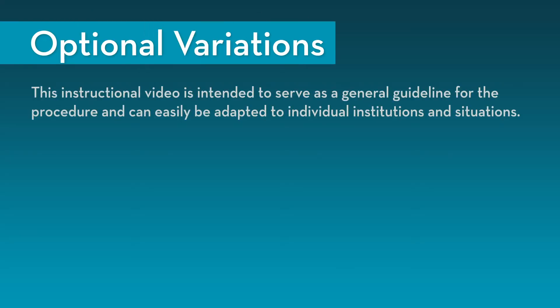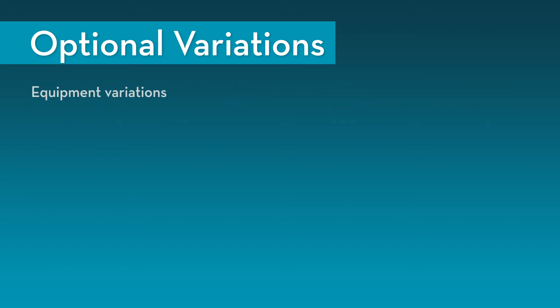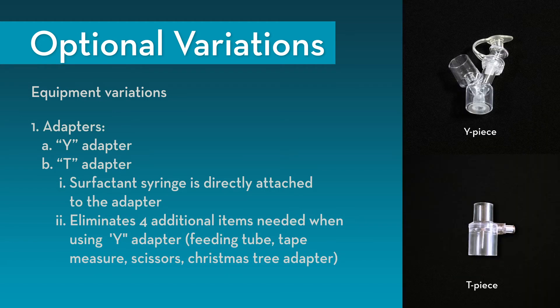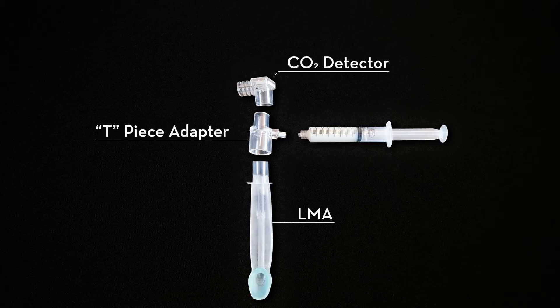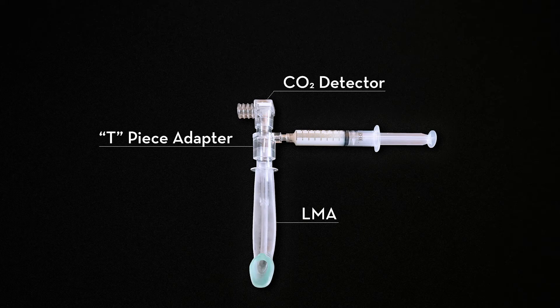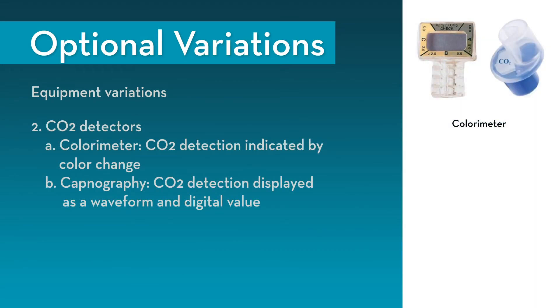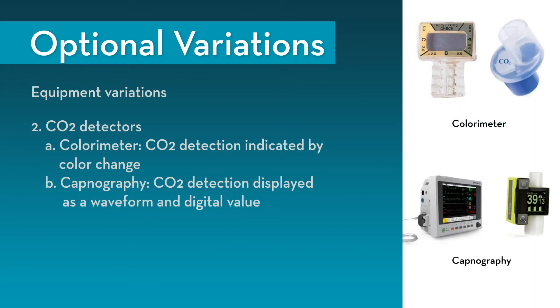This instructional video is intended to serve as a general guideline for the procedure and can easily be adapted to individual institutions and situations. The procedure can be performed with different forms of equipment. In addition to the Y adapter previously shown, T adapters are also available — with the T adapter, the surfactant syringe is directly attached to the adapter, eliminating four additional items needed when using the Y adapter.